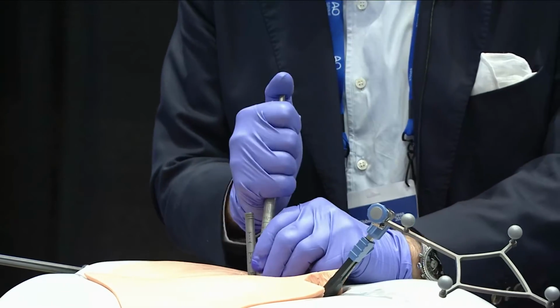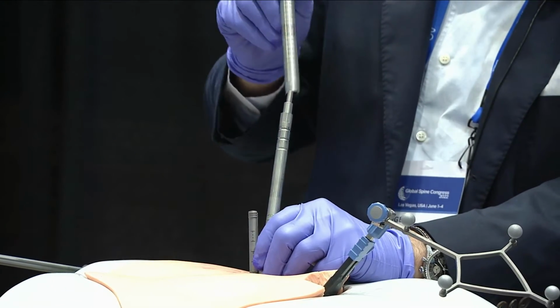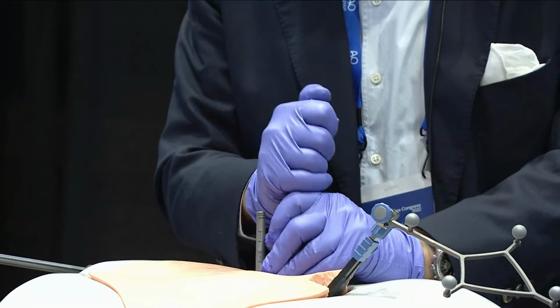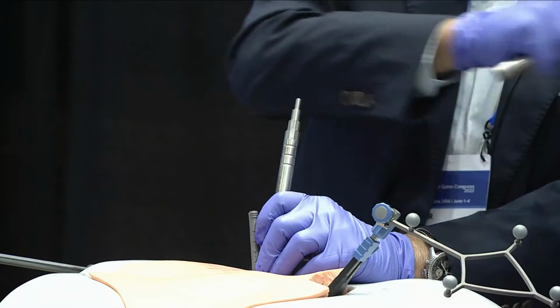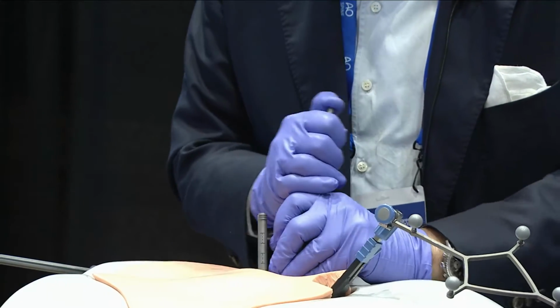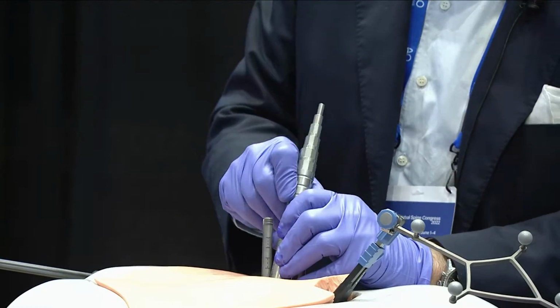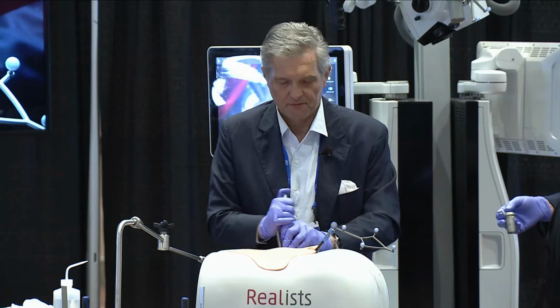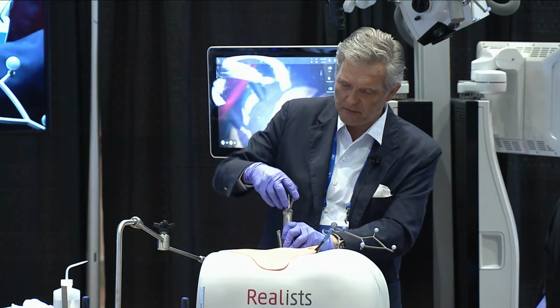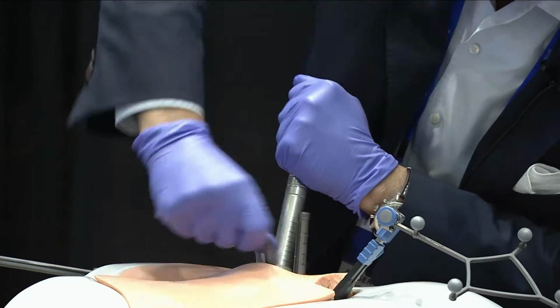And then obviously the more you dilate, the better it is in terms of getting rid of the muscle creep. Now this would be a 40 millimeter tube. And the angle of the tube now is almost the same that I would use for an MIS laminectomy, even for a discectomy. I change the trajectory later on. I'm sure we're going to have a little bit of muscle creep here in the model, but then you really spend time dilating through the fascia, through the muscle.